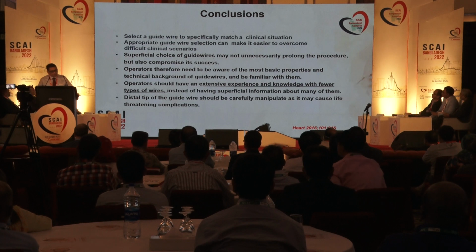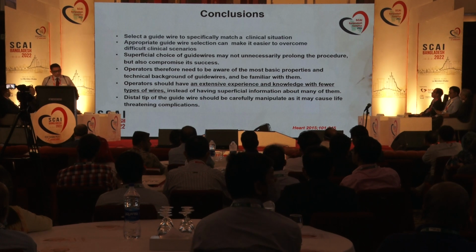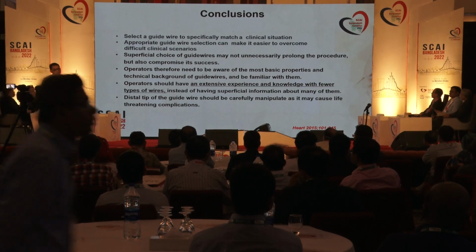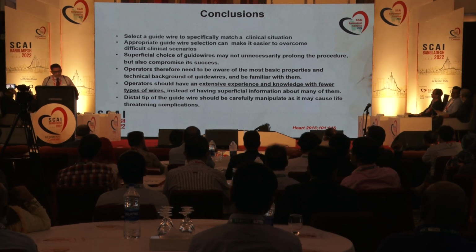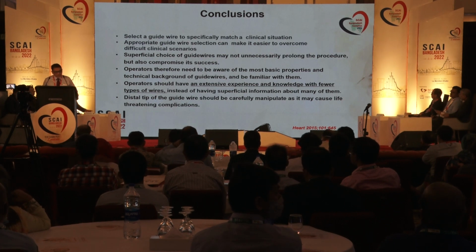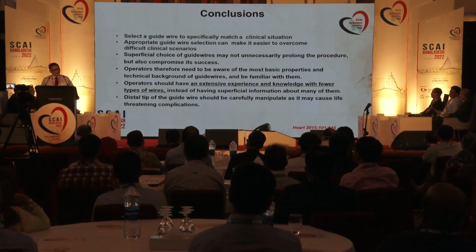In conclusion, appropriate guide wire selection can make it easier to overcome the difficult scenarios. Superficial choice of guide wires may not only unnecessarily prolong the procedure, but also compromise its success. The operator therefore needs to be aware of some basic properties and technical backgrounds of the guide wires and be familiar with them. Operators should have extensive experience and knowledge with fewer types of wire instead of having superficial knowledge with many wires. The distal tip of the guide wire should be carefully manipulated as it may cause life-threatening complications.